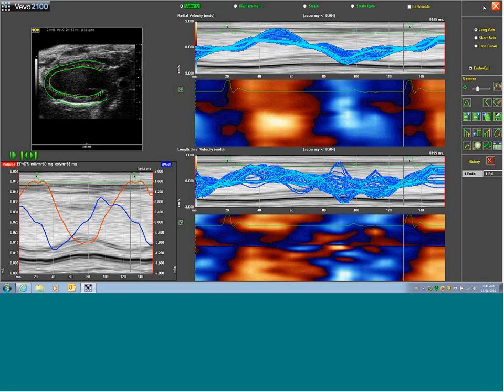Really, it's not optimized for other vessels, but if you have more questions about other vascular structures, this is where vessel strain would play a role. This is something on the roadmap for the coming year. We anticipate some release of this probably towards the second half of the year.